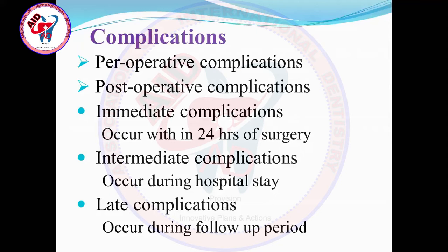Then there is judicious drilling of the bone while placing the screw. If you are not drilling with saline irrigation, what will happen? There will be heat generation. Due to heat generation, there will be more bone damage. Once the bone damage is there, there could be necrosis of the bone. Once the necrosis of bone is there, postoperatively you may end up with osteomyelitis. Or necrosis in the segments also.